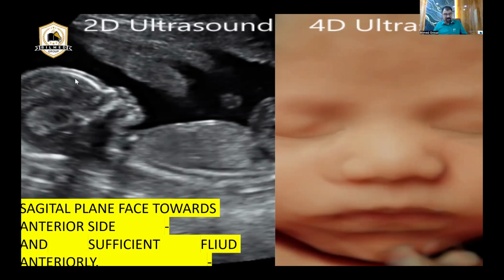Please try to understand. A sagittal section with face up, and there has to be some fluid in between the maternal wall or placenta, whatever, and the fetal face. If the fetal face and the maternal walls are very close to each other, you will not be able to see the fetal face.